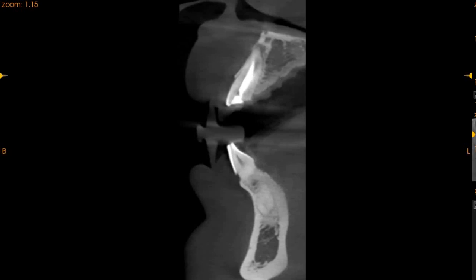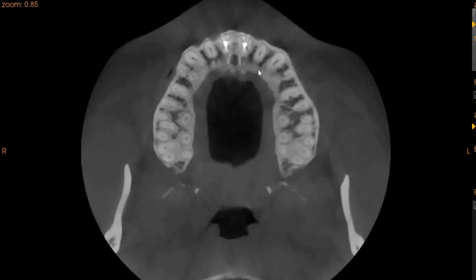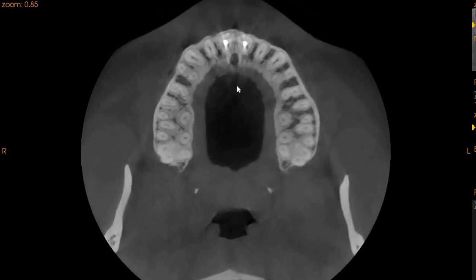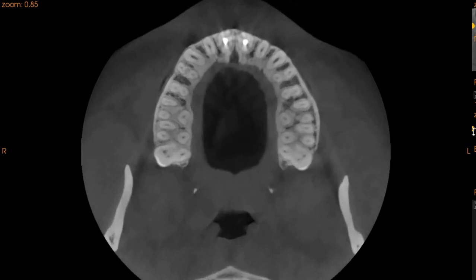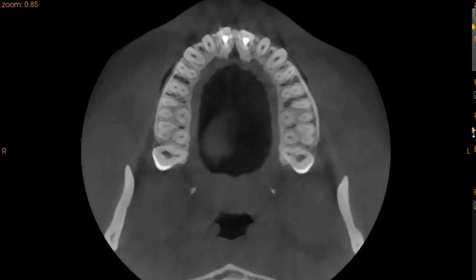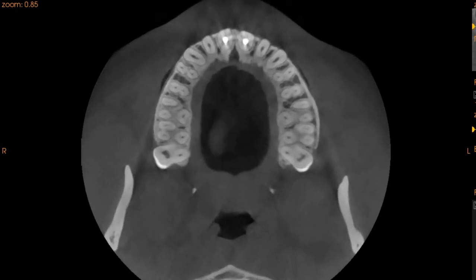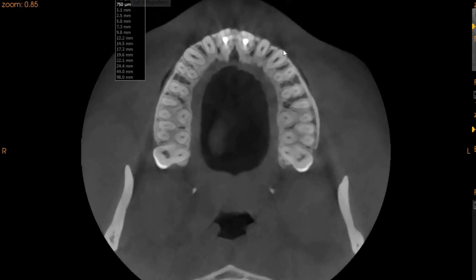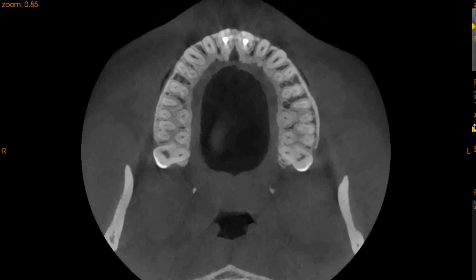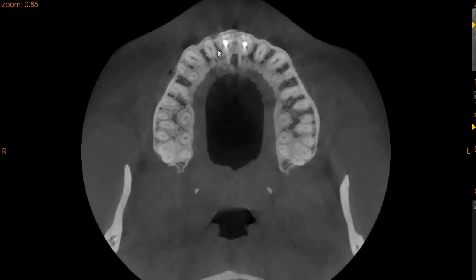If you have any further questions, we will also show you the transaxial view and now the axial view. This is the tooth from the axial section. On the axial section, we can see that the root canal materials do not show any signs of voids.